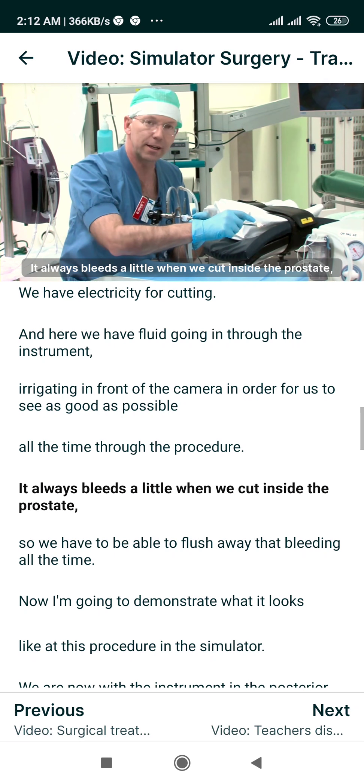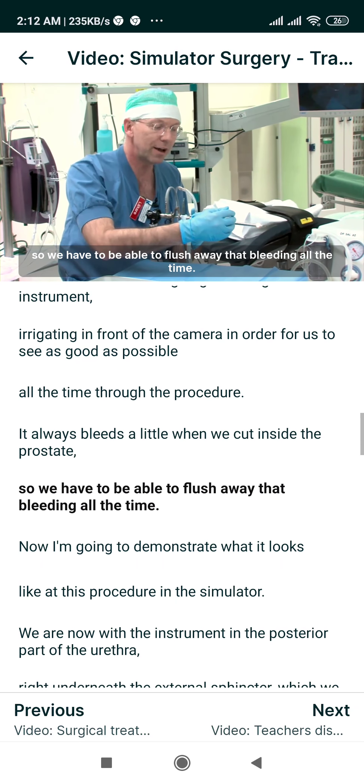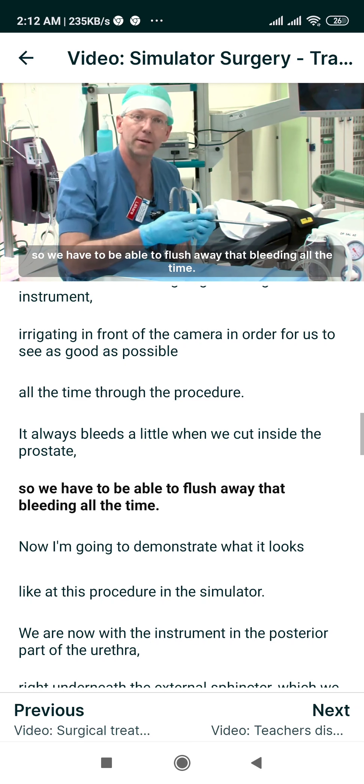It always bleeds a little when we cut inside the prostate, so we have to be able to flush away that bleeding all the time.